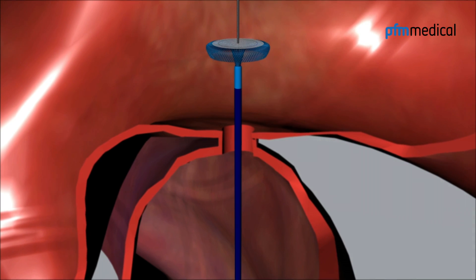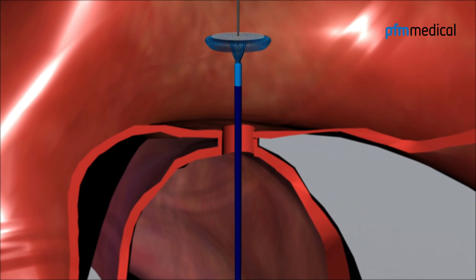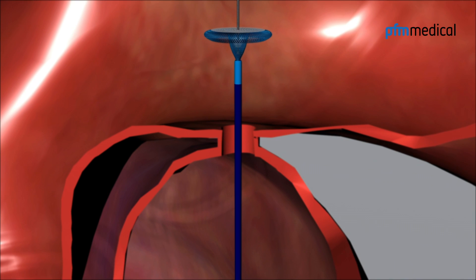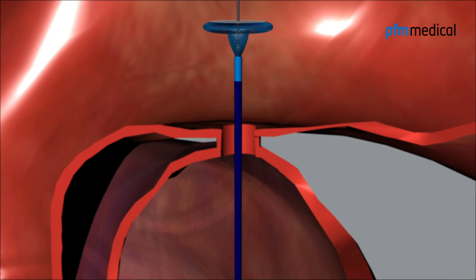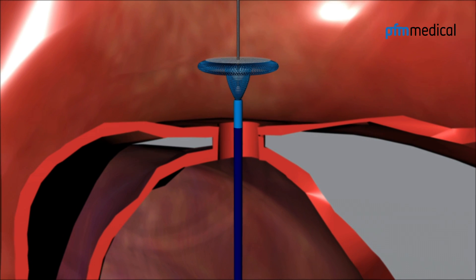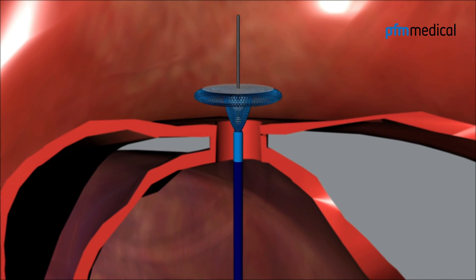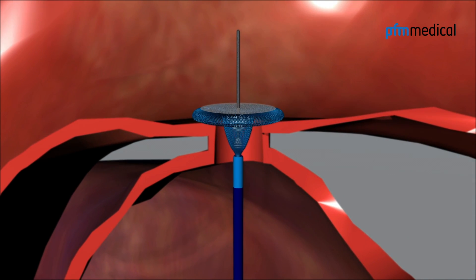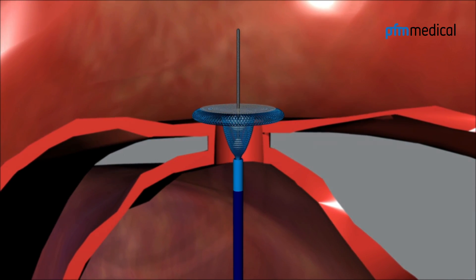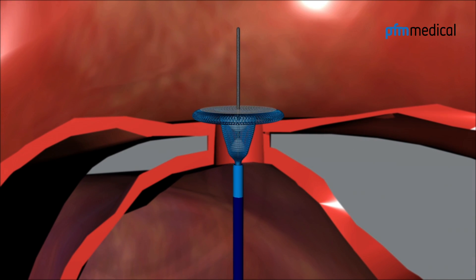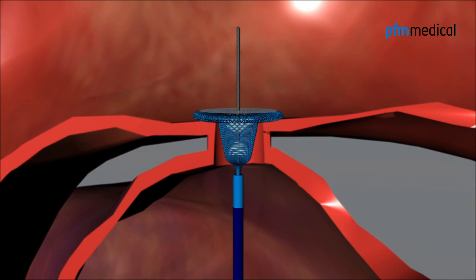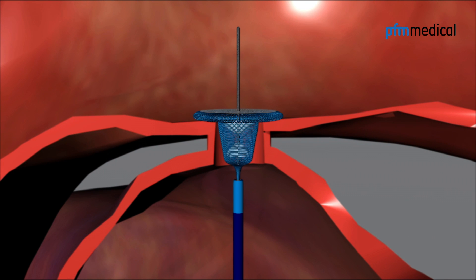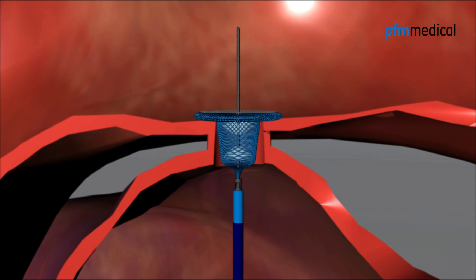The stent part is only partly configured at this point. The entire system is retracted until the occluder is carefully positioned inside the ductus. Now the stent part expands fully inside the ductus.